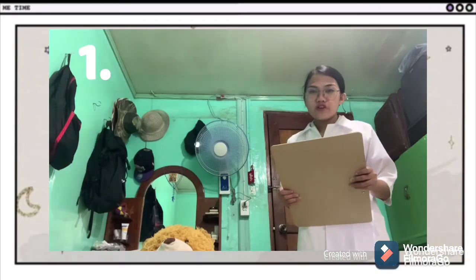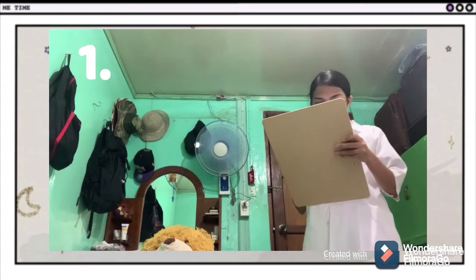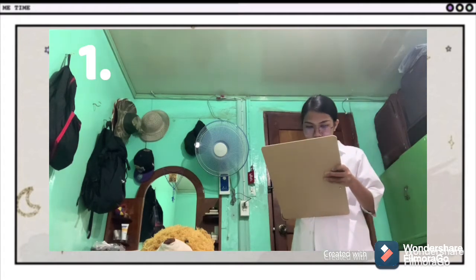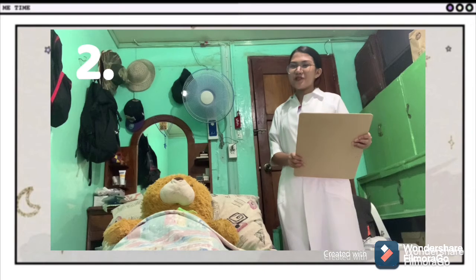Review the client's health record and check the client's chart for the physician's order. Catheterization is only done with a medical order. Identify the client and establish rapport.